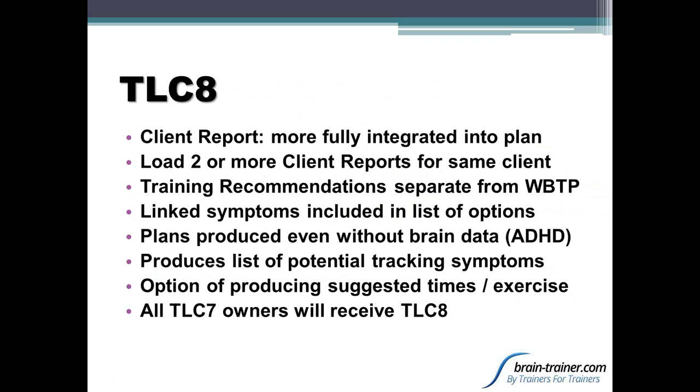People didn't come in because the theta to beta ratio was screwed up. They came in because they wanted to be able to do something differently. And so this allows us to stay focused on real life issues to tell us how effectively the training is working for a client. And everybody who has the TLC7 will get the TLC8. There's no cost for upgrading or anything like that.